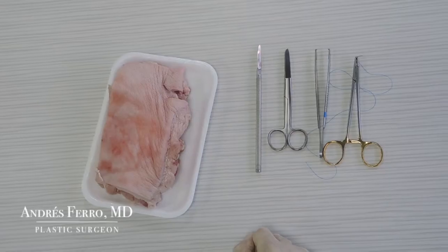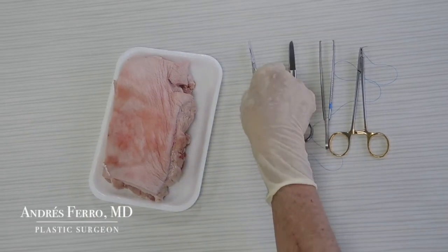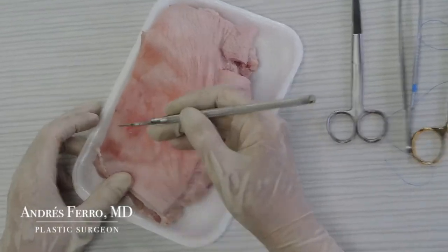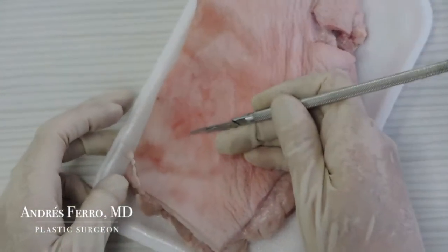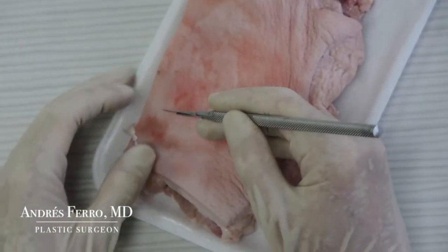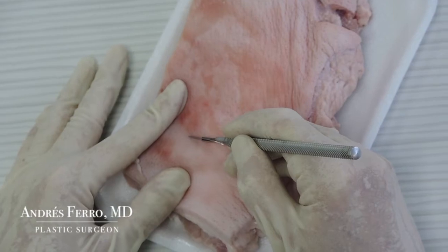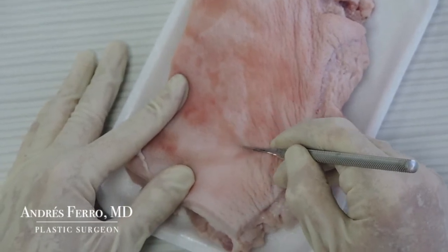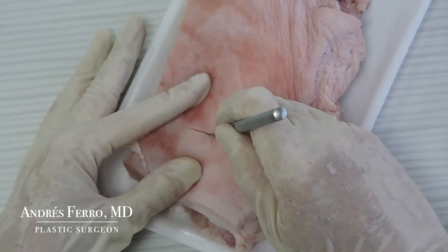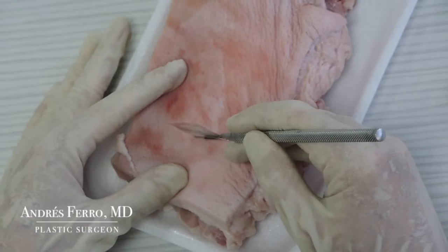We will start the practice on the porcine skin. Take the scalpel. Whenever making an incision, secure the support of your hand. The incision should be made with the scalpel angled approximately 30 degrees. With your non-dominant hand, tighten the tissue. Make a firm cut of about 6-7 cm. Verify the incision and complement it with other incisions, extending them to the subcutaneous fatty tissue.